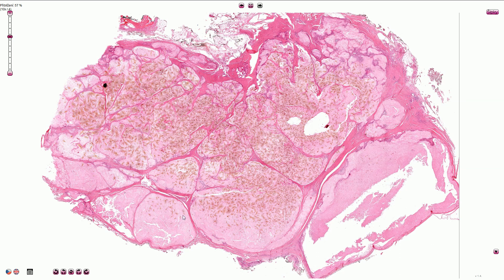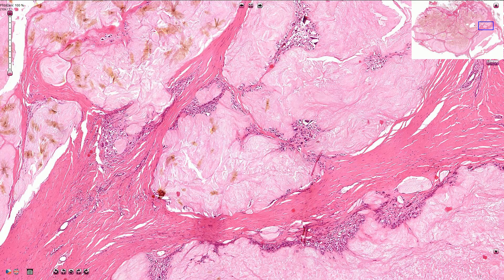In this slide we can see multiple nodules of pale pink amorphous material. It can sometimes be associated with foreign body cell reaction with multiple macrophages and giant multinucleated cells.